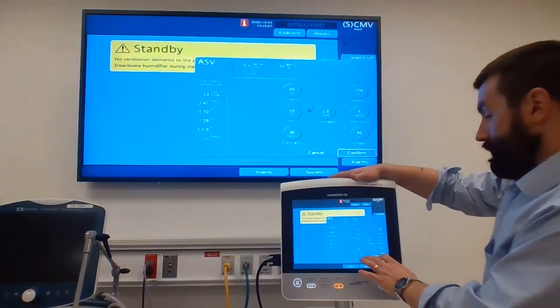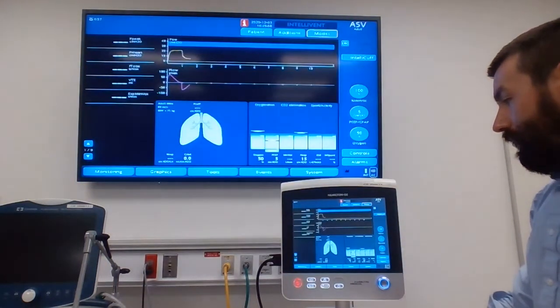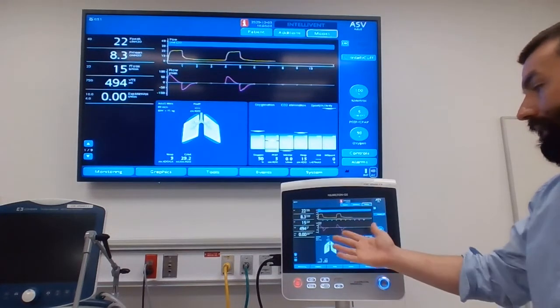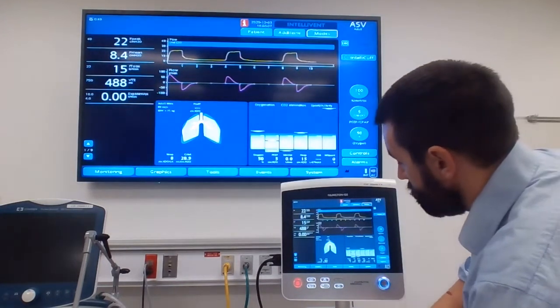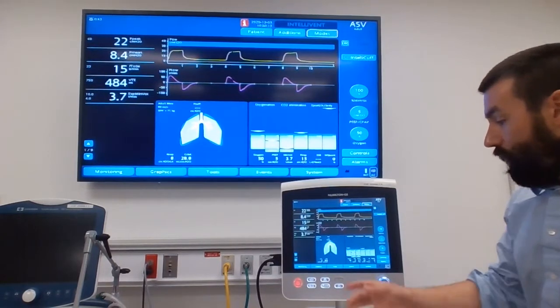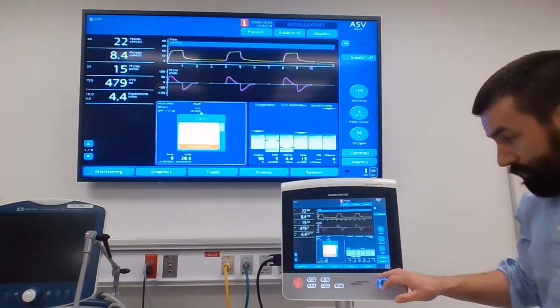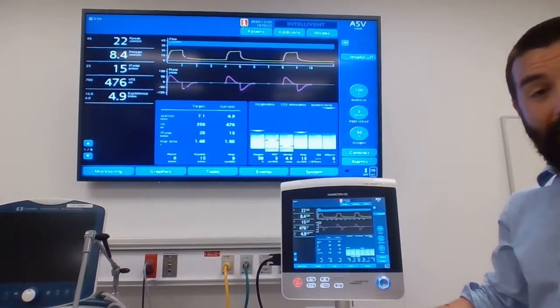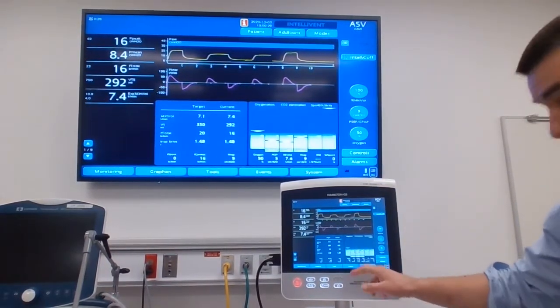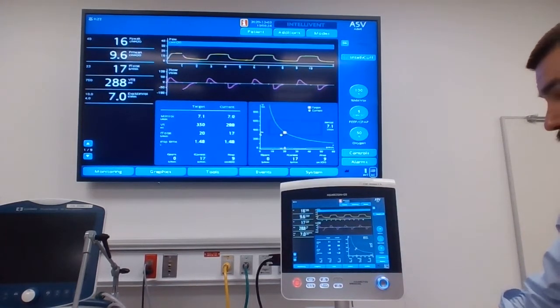So what we're going to do here, I'm going to go ahead and go to confirm. I'm going to go ahead and start ventilation. So it's going to take just a second here. We'll let everything begin to register. All right. And then I'll show you a couple of things that I change here. If I'm running ASV, what I like is to originally look at the ASV monitor. We'll talk about the vent status graph and everything. This can be useful as we approach weaning, but I also like to look at the ASV graph.